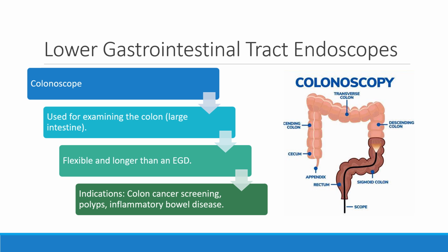So again, think of in terms of the flexible endoscope needs to be able to make all of those turns and curves with our GI tract, so we need to have a flexible endoscope. If we used a rigid endoscope, it simply would not work. It would just end at one point.